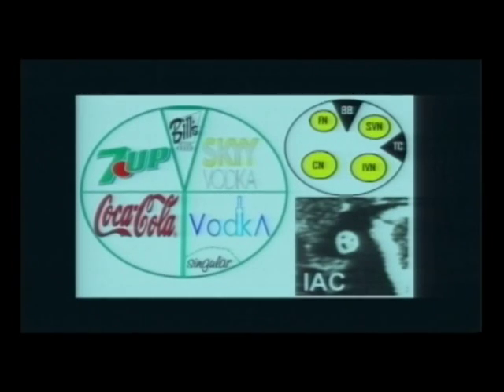So that's very important. The first thing I do now is whenever I see a patient for a cochlear implant, I look for the nerve, the first thing. I have to check. I don't care about the inner ear, because sometimes they have a fully developed inner ear without a cochlear nerve. So you have to look at the cochlear nerve. And this is how the internal auditory canal looks. So somebody might forget this one of these days.